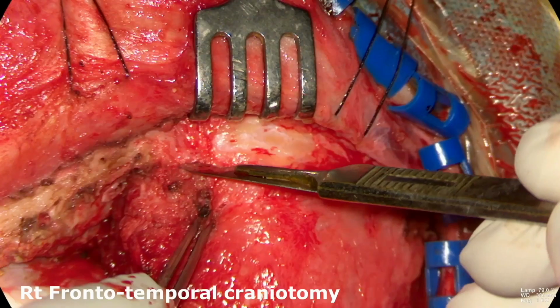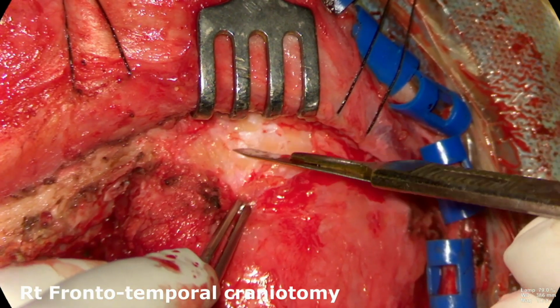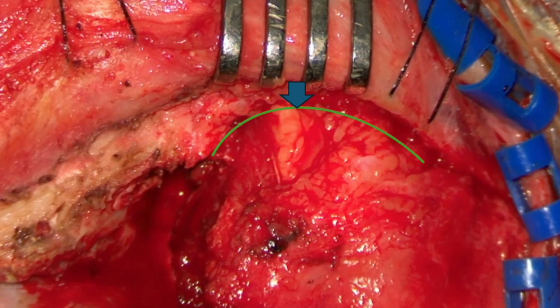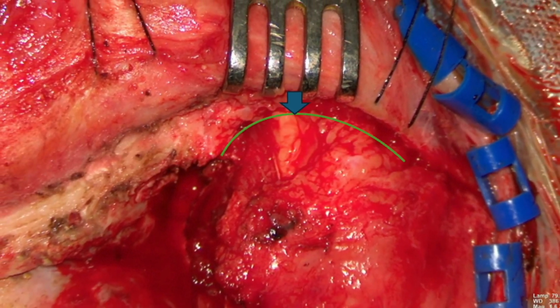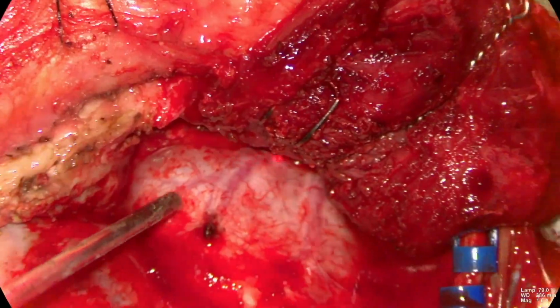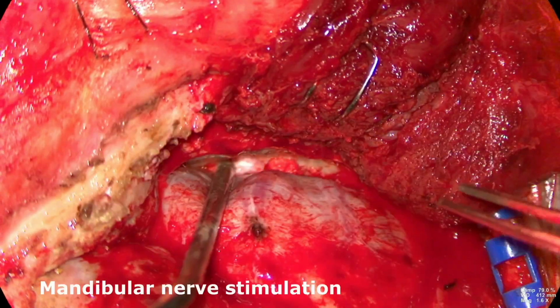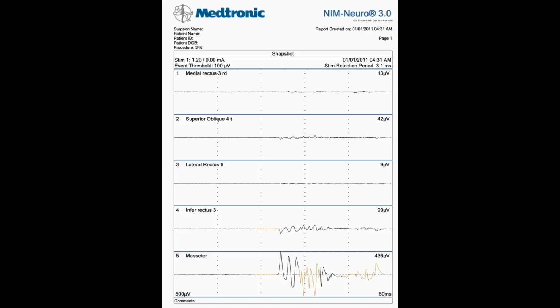Right frontotemporal craniotomy was done. Zygoma was lowered. This green line was showing the original zygoma lining and the blue line is showing this much of zygoma was lowered. Craniotomy edge was flushed with the base. This is the stimulation of the mandibular division of the fifth nerve.